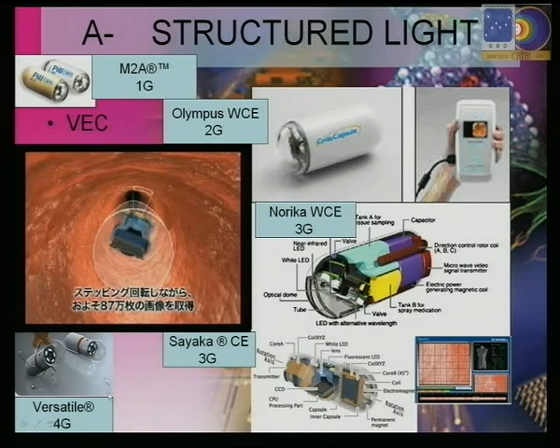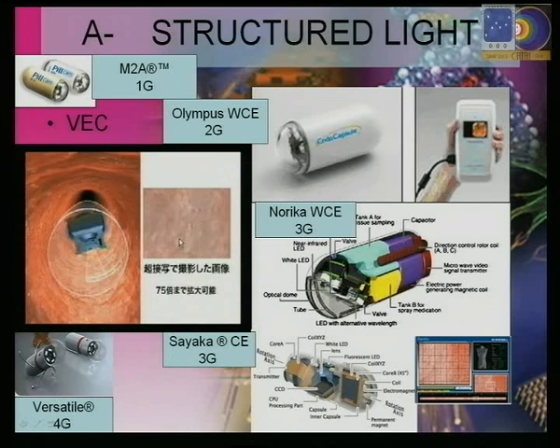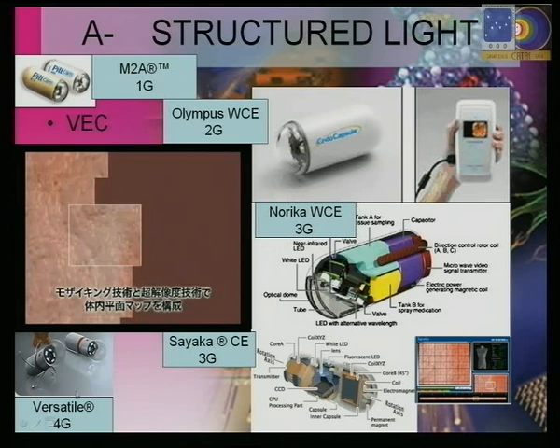Taking pictures of all around. The speed is very high and you are taking different pictures. You are sending the pictures outside. Obviously this is a wireless connection. And in the system outside, the pictures are getting built in a mosaic form.